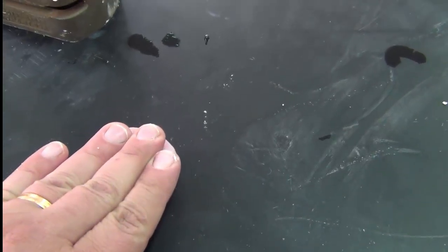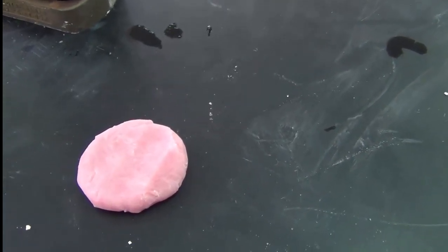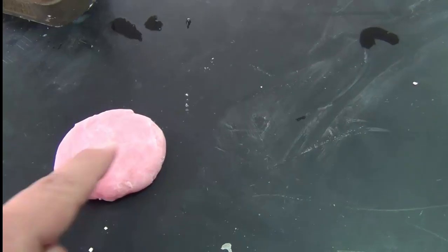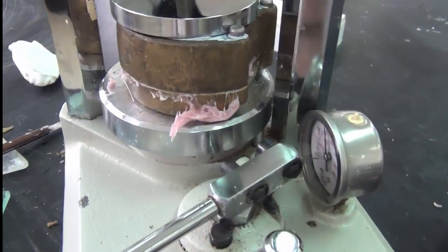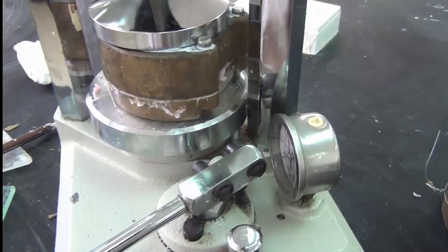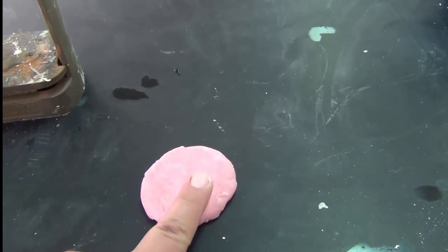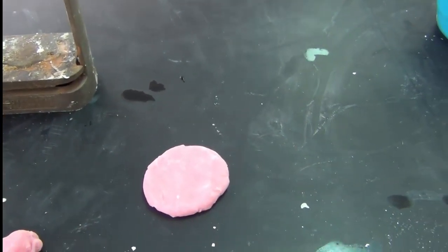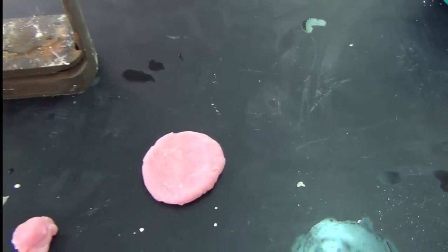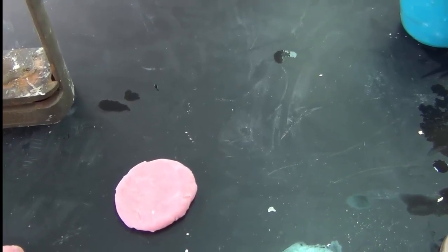And also, if I want to squeeze it into place and let it go into the minor details of the denture or the interdental papilla, this will not flow easily as the dough did. Using the press, if I put the rubbery material under this hydraulic press, because it's very strong and this rubber is resistant to the pressure, rather than flowing, it will either fracture the cast or move the teeth away. So we don't place this acrylic in the rubbery stage in the packing procedure because it will produce changes in the dimensions or move teeth into the layers of the flask.